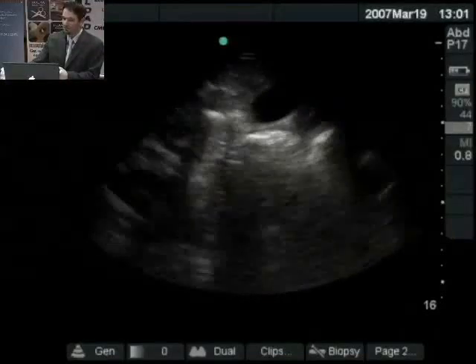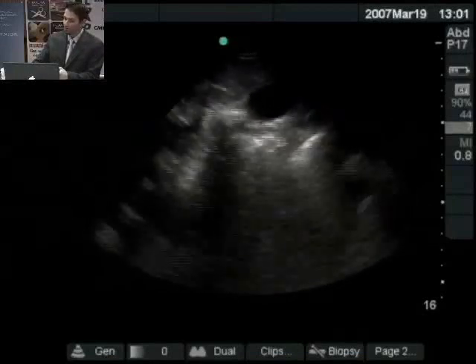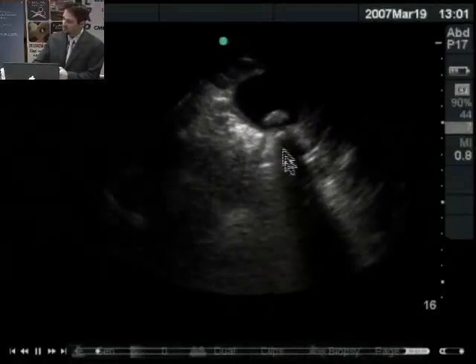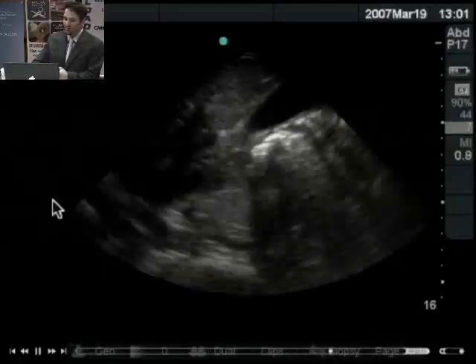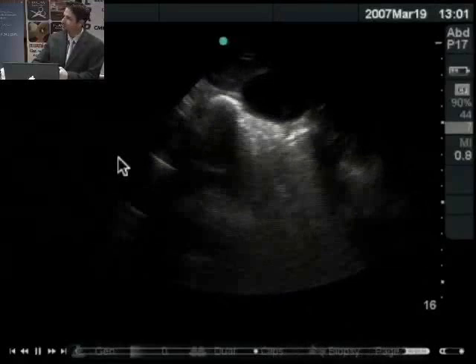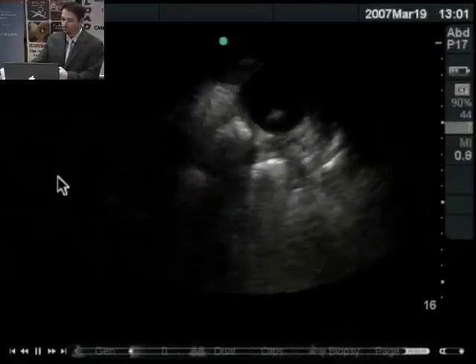This is hard to miss, right? And yet it's only in one place of the gallbladder. It's only up in the fundus. The stone is kind of sitting here, hanging out, casting a dense shadow. And then here's the neck of the gallbladder and not a stone in sight. So crucial to look through the entire gallbladder.